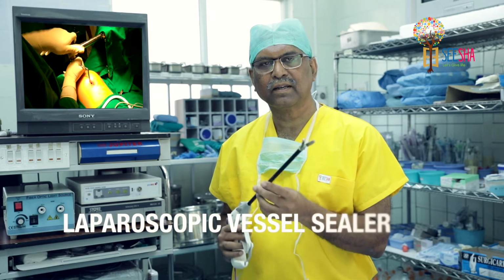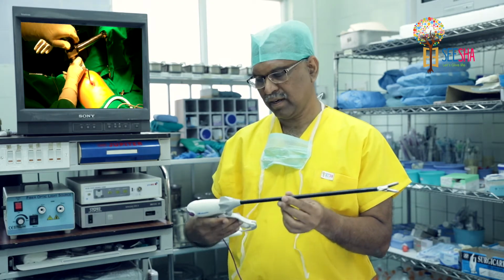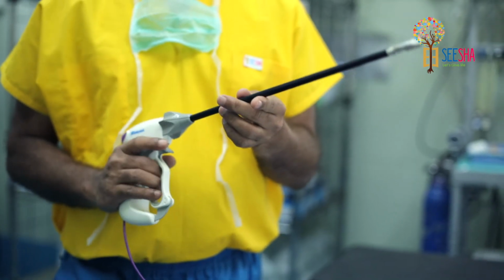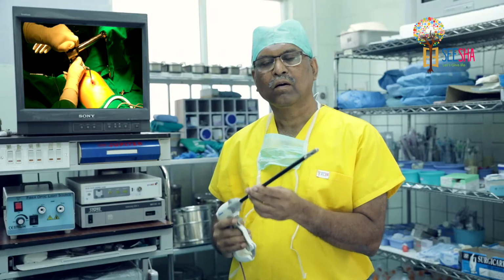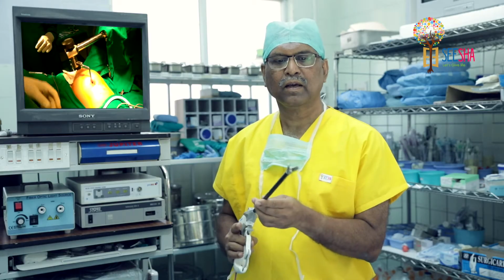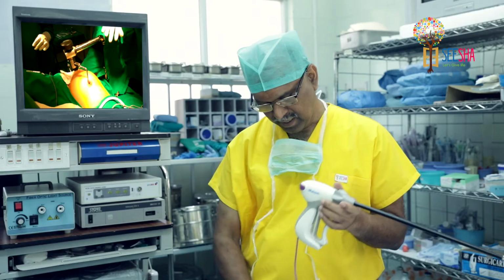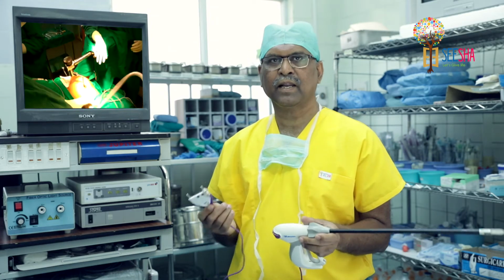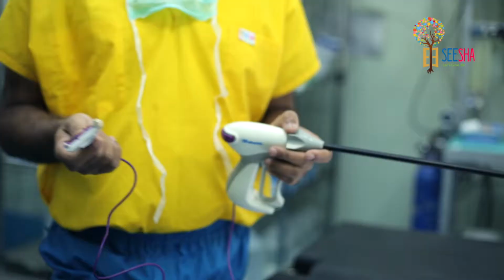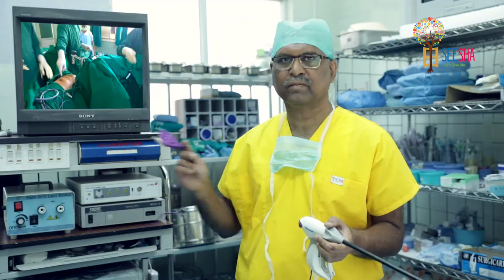When we are doing procedures, especially single incision surgeries, vessel sealing equipment like this is very handy. We can remove the ovarian cyst or half the ovaries or whatever is necessary without causing damage to the other tissues using the vessel sealing. Although these are made by Valley Lab, it is possible to connect them to many of the locally produced generators like the Allen's generator that we have.